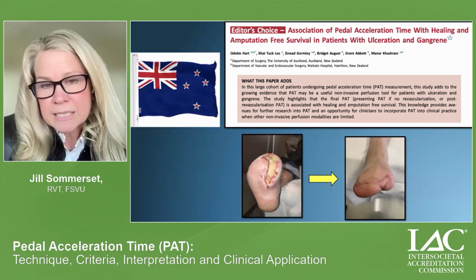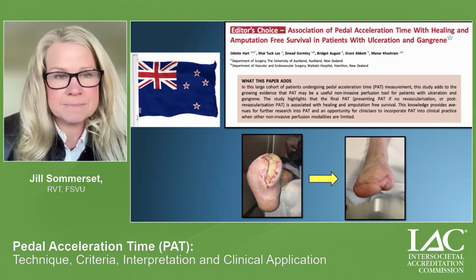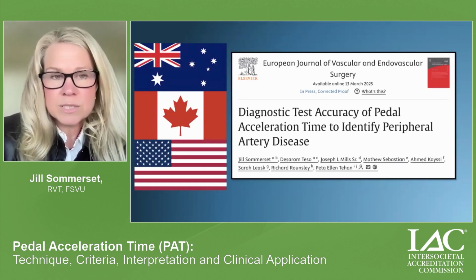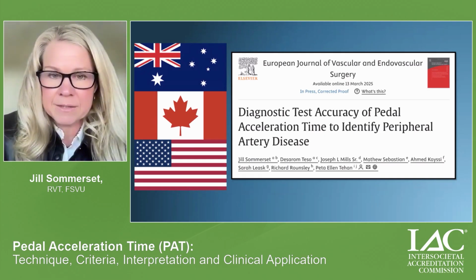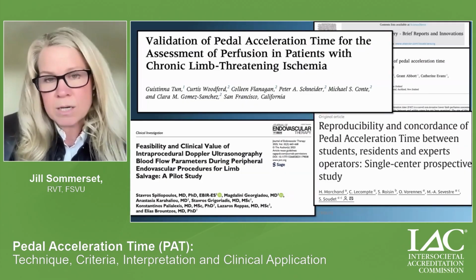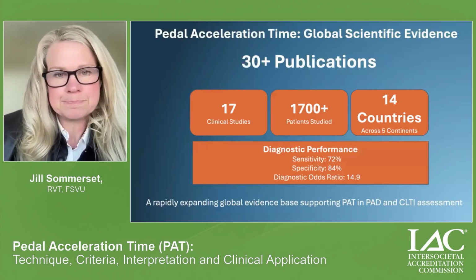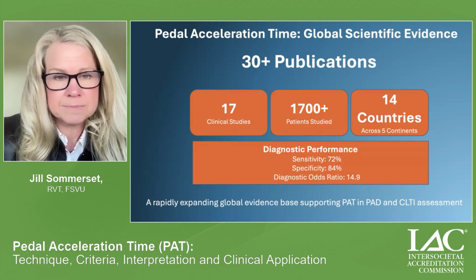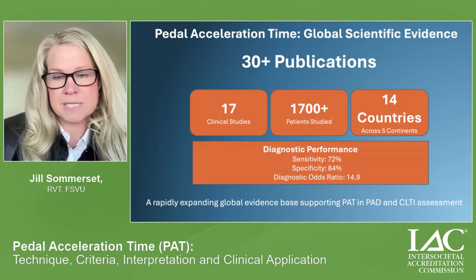This is a nice paper out of New Zealand where they looked at PAT as a surrogate in patients with a forefoot amputation. And more recently in 2025, this is a multi-center study looking at the diagnostic accuracy of PAT. So these are all papers, and there's more that I think are worth the read if you are interested. So to date, there's been over 30 peer-reviewed papers, 17 clinical studies, and that involves over 14 countries.